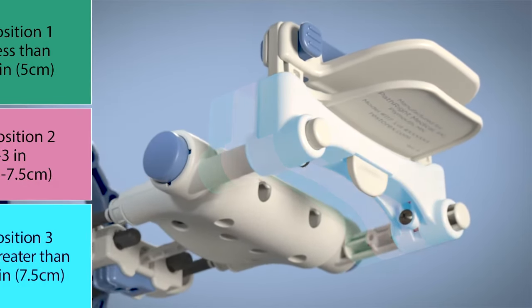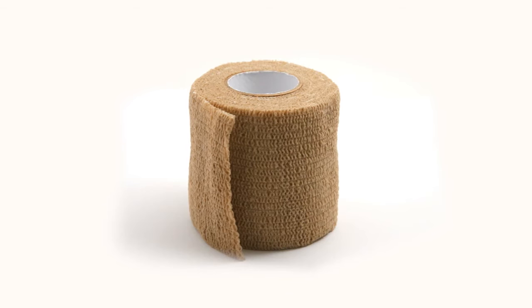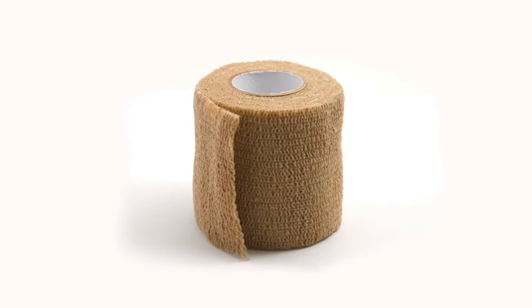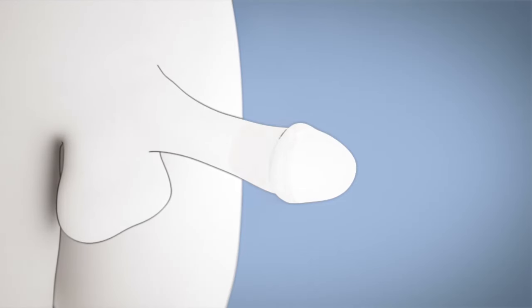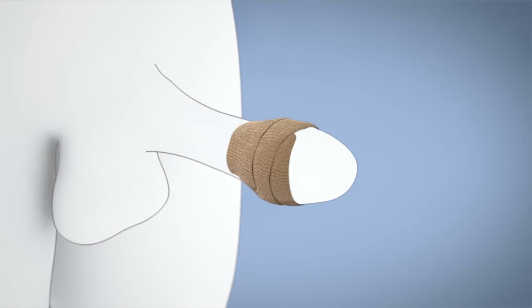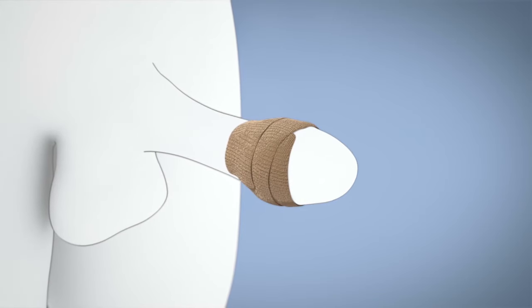It is recommended to use the enclosed self-adherent wrap to improve comfort. Wrap the penis two to three times as shown. Do not over tighten. However, if worn too tightly, it can restrict blood flow to the penis.